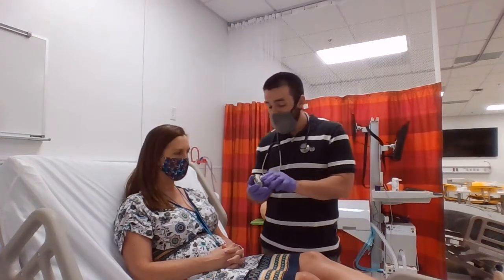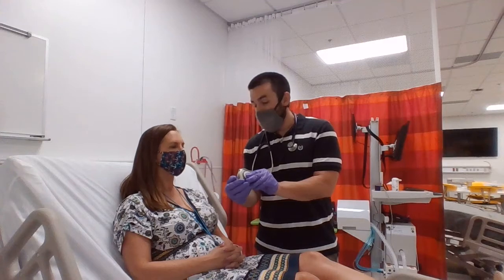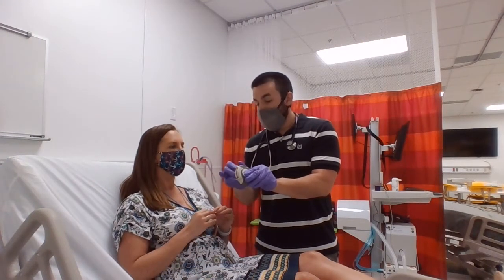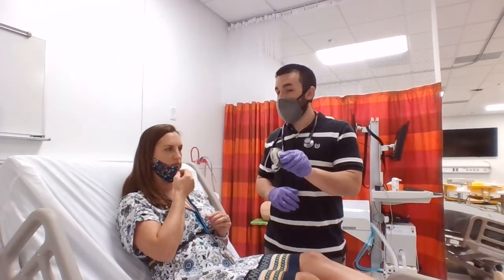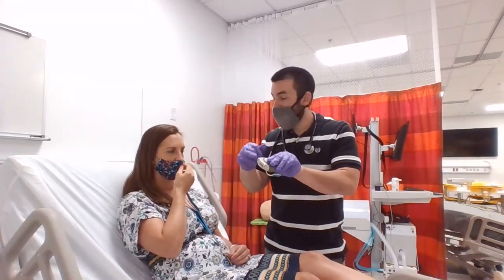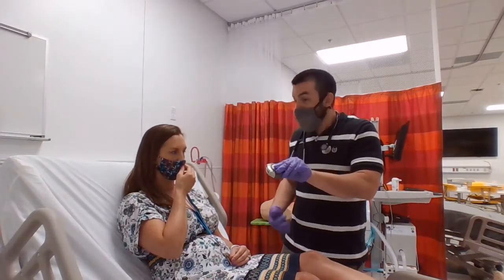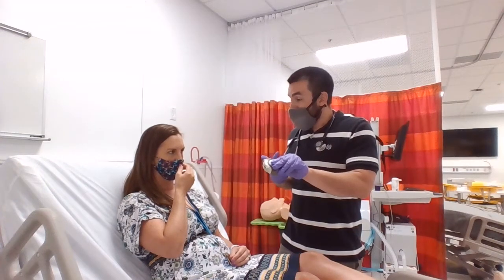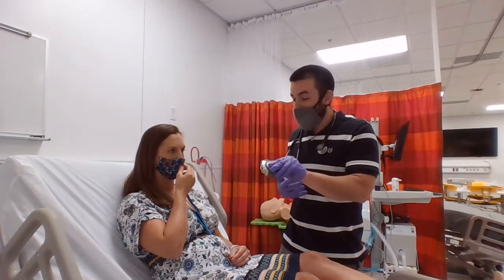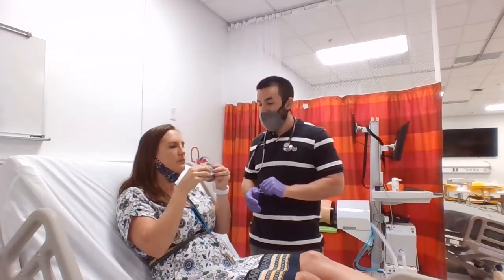Okay, so what you're going to do, I'm going to puncture this first one for you. We're going to keep it in this upright position. You're going to go ahead, normal exhale out, so get out the old air just like before. Seal your lips around that mouthpiece. But this one's got to be a faster breath, so you've got to pull that dry powder out of there. You're going to take as deep of a breath as you can, and then try to get a good 10-second breath hold. Okay, I got this punctured and ready to go, so be very, very careful with it. All right.